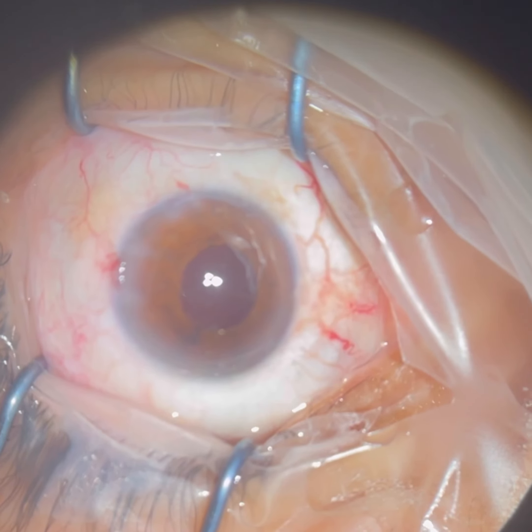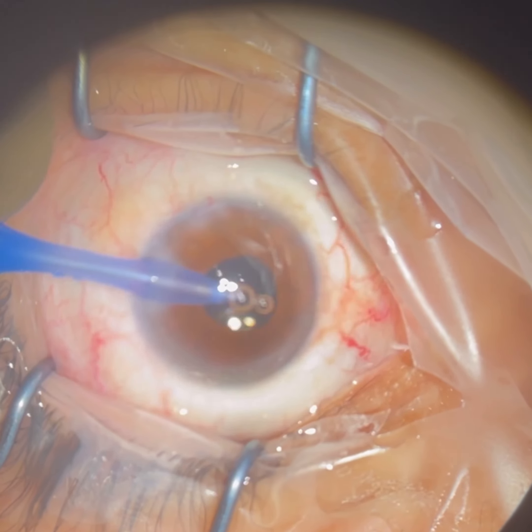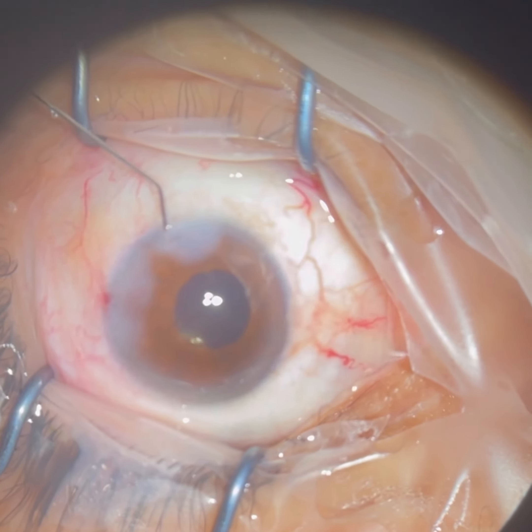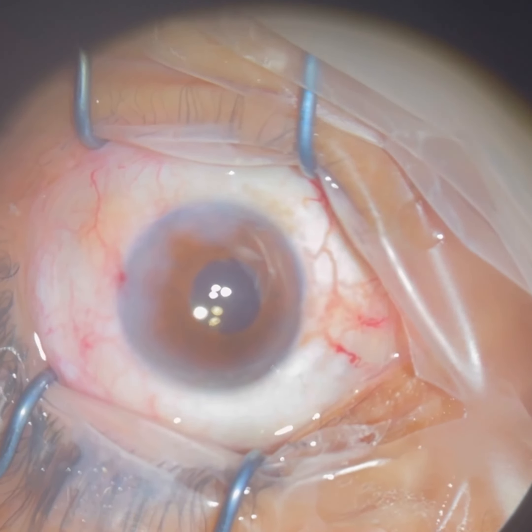Here we're removing that ring device, and the pupil you see comes back down to normal size. We're removing all the gel material, and the eye is left with the natural fluid. Here we are hydrating the wounds with antibiotic material so that the eye has no infection, and the eye will heal very well in a day.